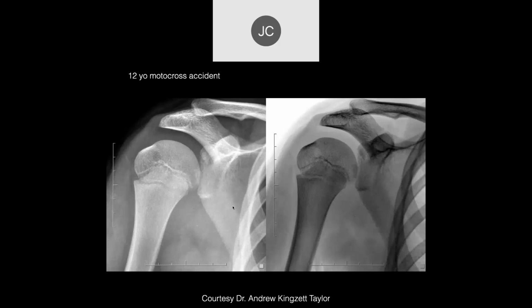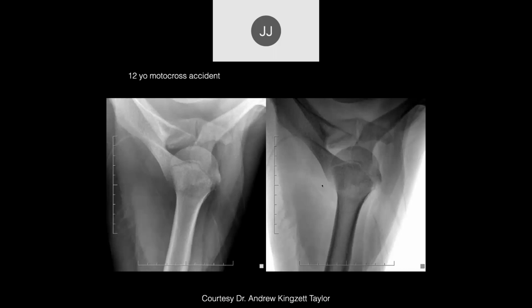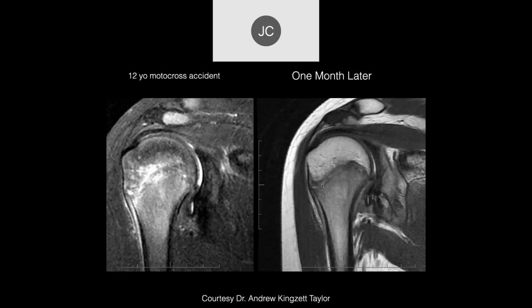Okay, so we have a 12-year-old motocross accident. Looking at the superior glenoid again, I think there's a little lucency there, maybe. A lot of irregularity down through here. Remember about this age group, the soft tissues are strong and firm. It's the bone that usually is injured. Okay, so we see some glenoid irregularity on the plain films. Here's the MR scan. Looks like there's a lot of edema along that lateral aspect of the physis, and surrounding it. And this is a month later.